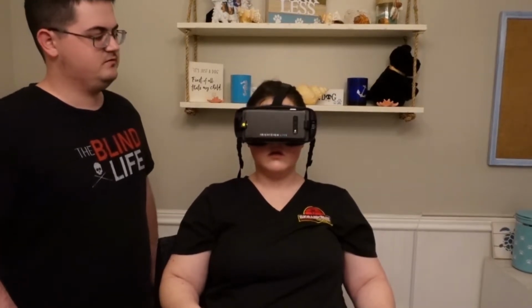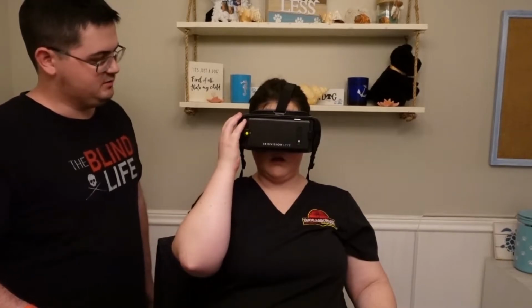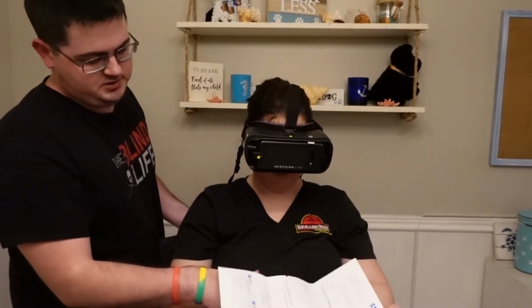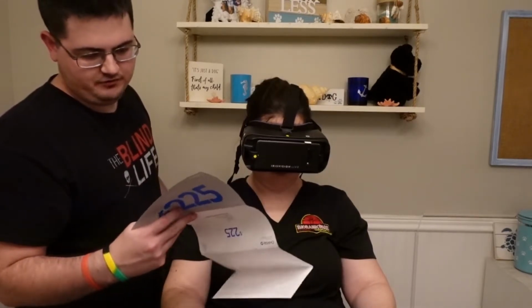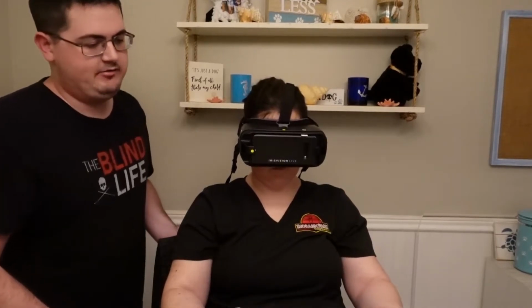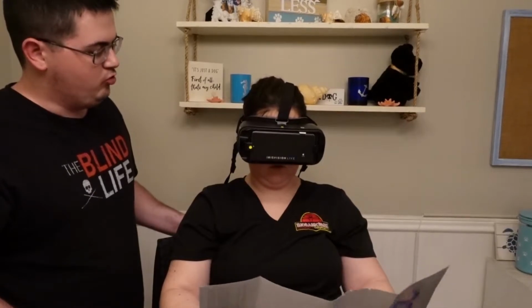After that, we have reading. If you press the button, please. All right. So we have here a piece of junk mail. Yep, we get junk mail too. We can't read it. But we might be able to read it using the IrisVision Live, but I don't think we're going to be able to do it normally.